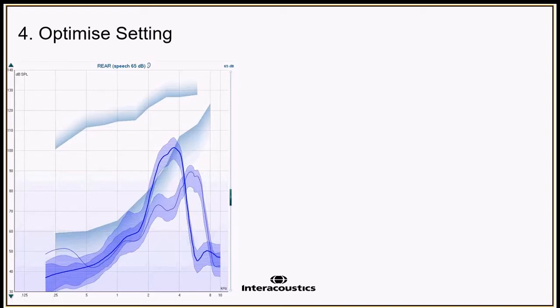It does take a little bit of getting used to, mind, because it is changing the signal that they would have typically been used to had their hearing been normal. It would seem a bit strange for them initially, but it's giving them a wider range of frequency sensitivity than what they had before, or at least detection of that. It's here that you then optimize the setting.